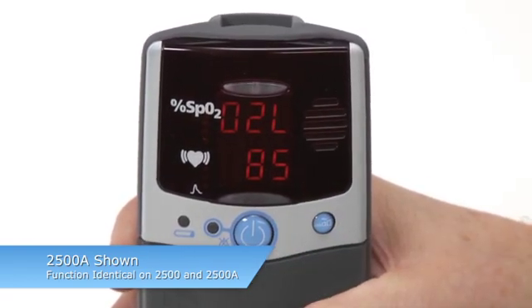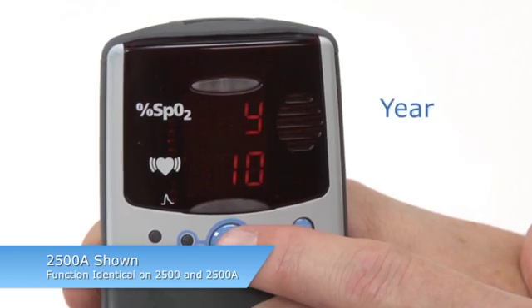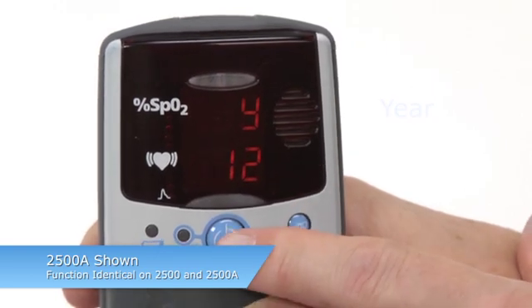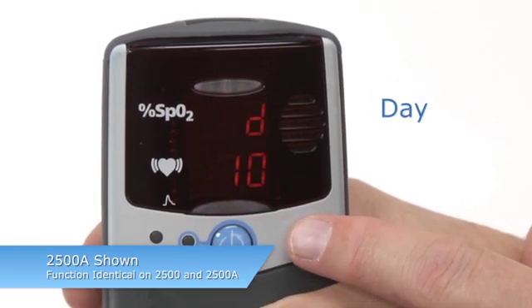If you do not clear memory, you will automatically continue to the rest of the setup options. Year, month, day, hour, and minute will appear in that order as you adjust them. Change the value by pressing the ADVANCE button until the desired value appears, and then press ON-OFF to set that value. The next value will then appear.